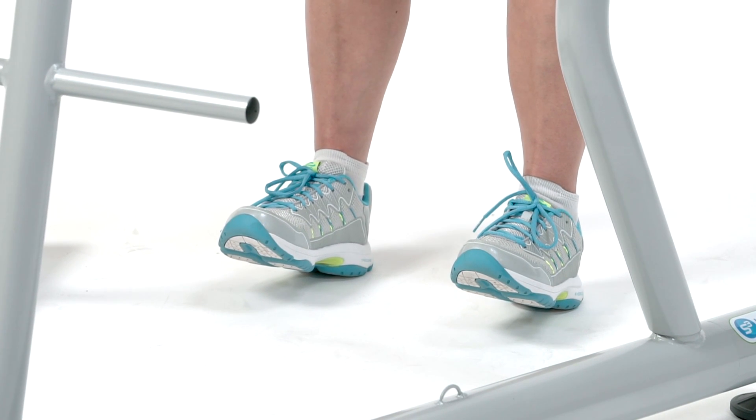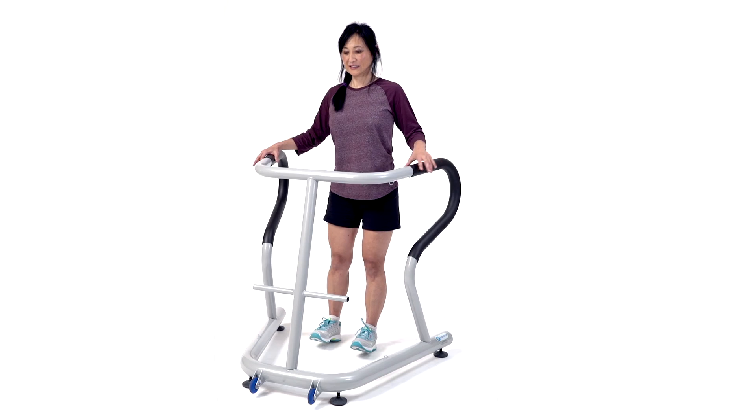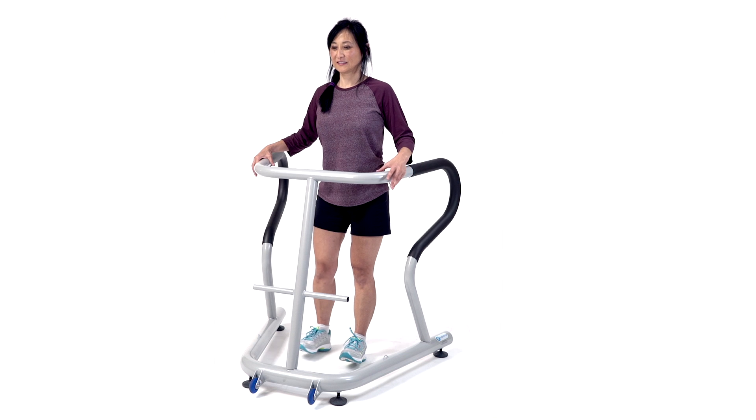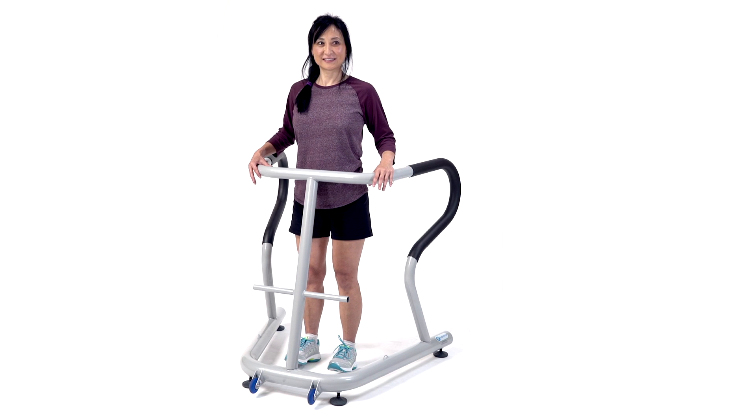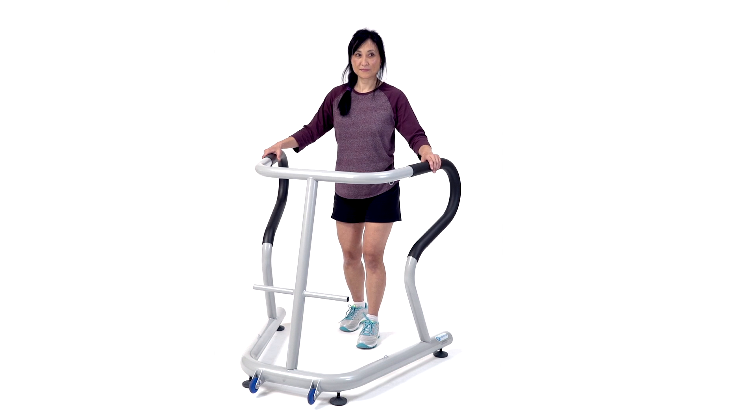Then slowly walk forward to the front of the device. Great. And then just walk normally back. And repeat as needed. Good job.